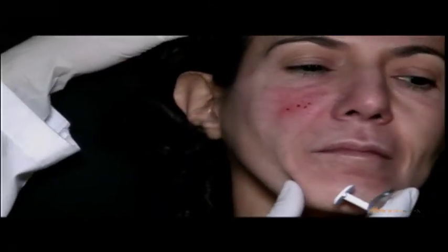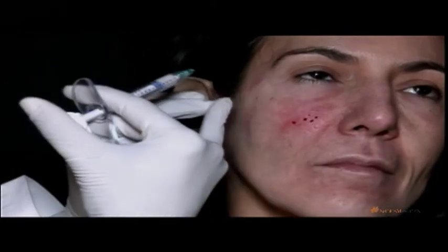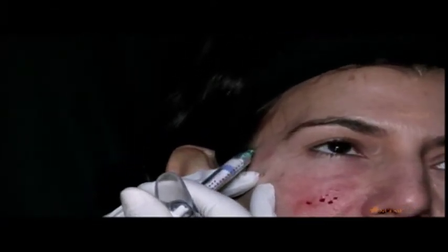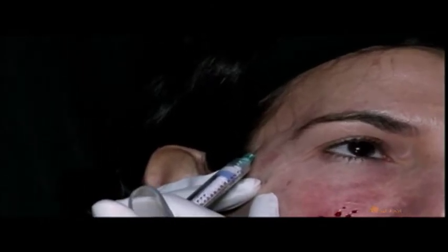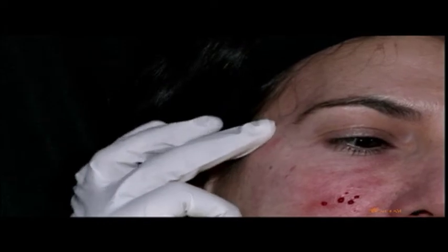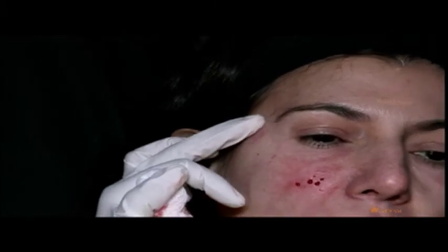I'm now going to show you a little bit in the temple. And what I'm tending to do in the temple these days is go quite far back and vector it into the hairline. So I'm injecting here just above the bone, supraperiosteally, to avoid encountering the temporal branch of the facial nerve, which is going to come up over the midpoint of the zygomatic arch. It's going to pass through the temporal fossa and then curve over the brow. The other advantage of going posteriorly like that and angling my needle is I get a very nice lifting effect.